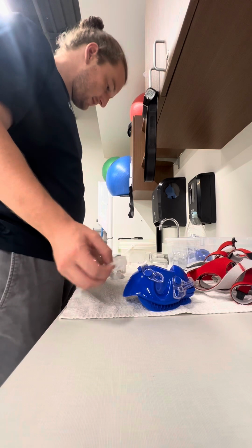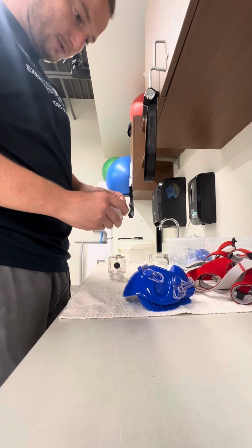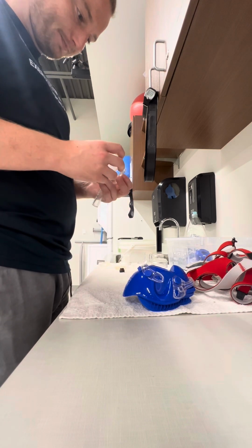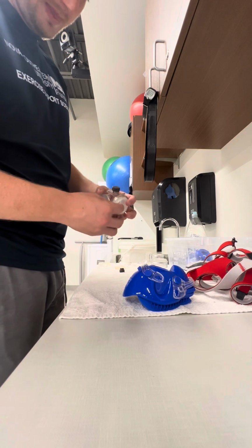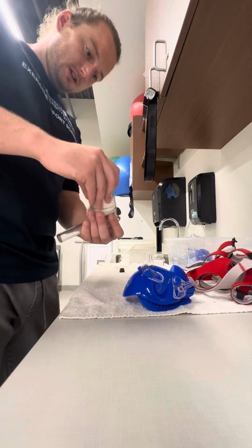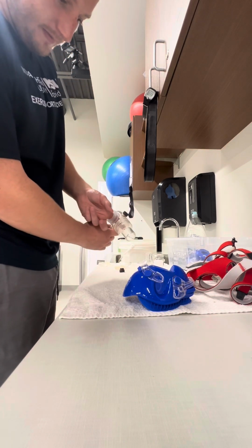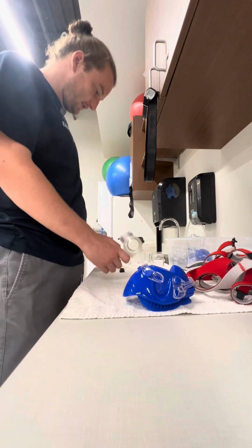Need our diaphragms, 2 diaphragms. One goes in like so. This will be the air out, as the arrow is pointing out of the mask. This clear piece goes on like so. Now we have our air coming out for the tube to connect to here.